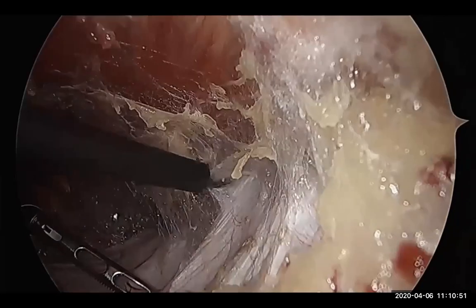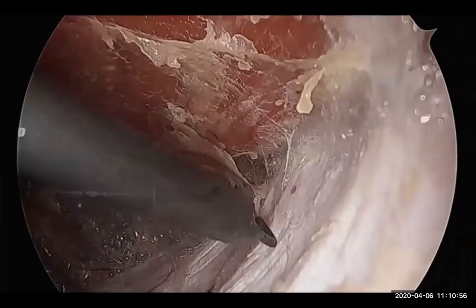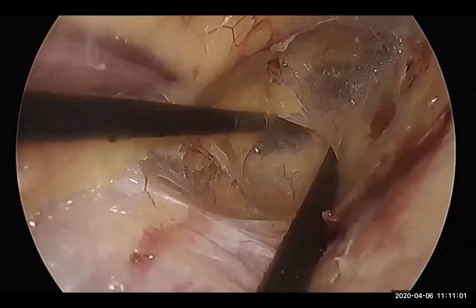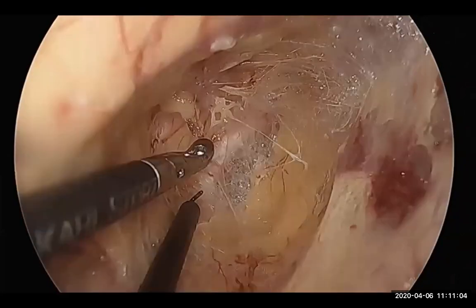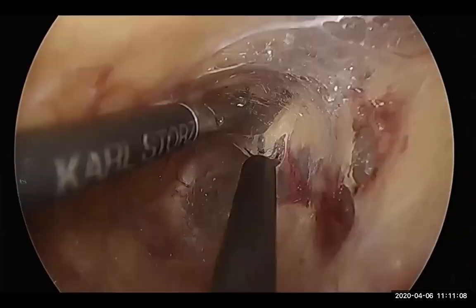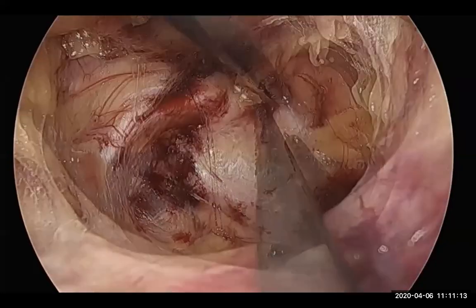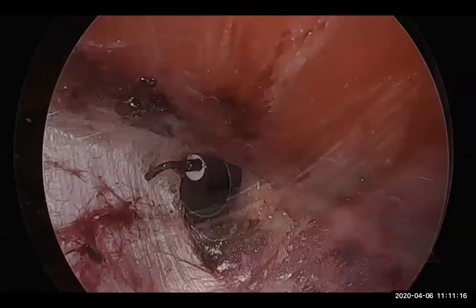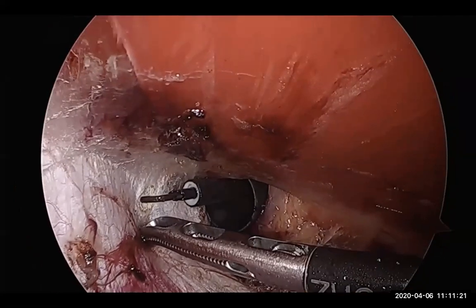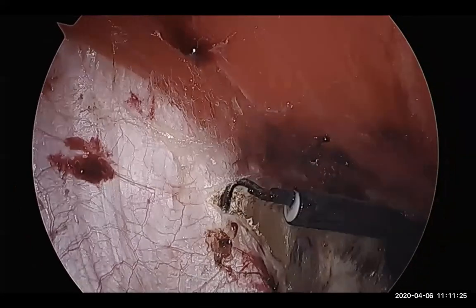And you can see that the space is being created towards the midline. You don't need to worry much about the midline dissection. You can see the inferior epigastric. We are looking from above down, and the retrorectus dissection now goes towards the inferior limit, which is the cave of Retzius. So you stay in the same plane as in TEP, and now you shift the camera to the lowermost port, and through the uppermost port, you pass a hook diathermy and do the midline crossover.